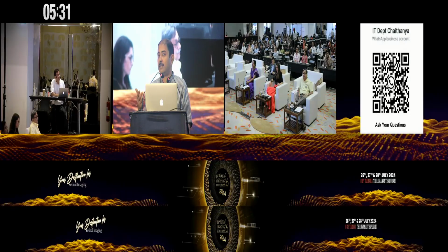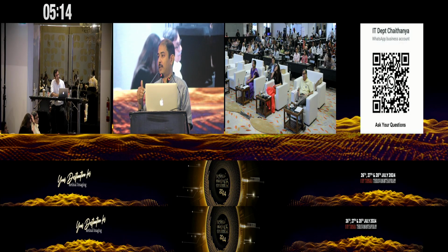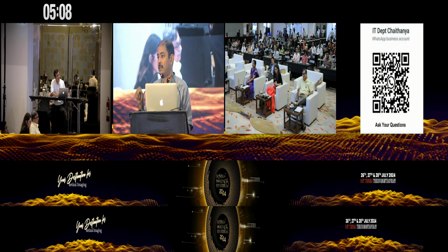Since we are talking about when the patient comes to you, at that particular moment, what exactly is the age or stage of the life of the drusen is very difficult to say in one go. But on follow-up, if you're looking at higher drusen volume, and of course there are hyperreflective foci, or there is intralesional non-homogeneity, you would expect it to collapse and have a GA formation there.